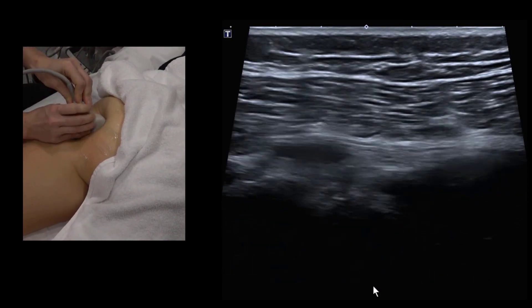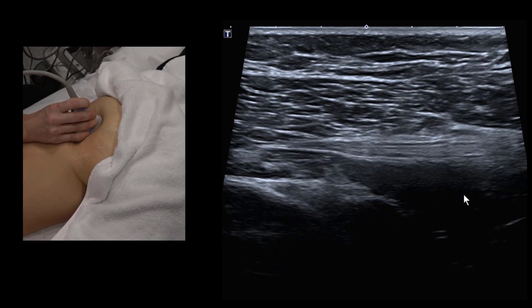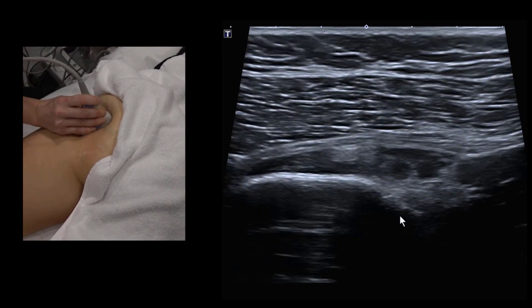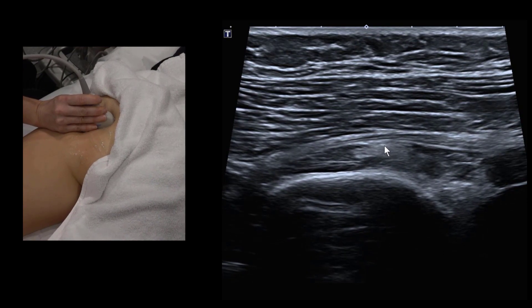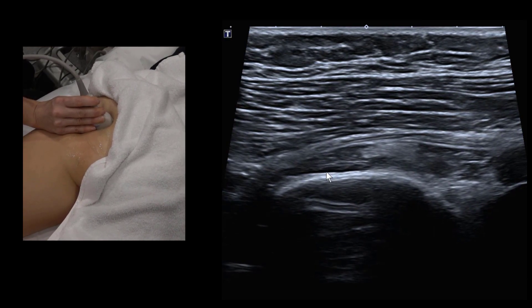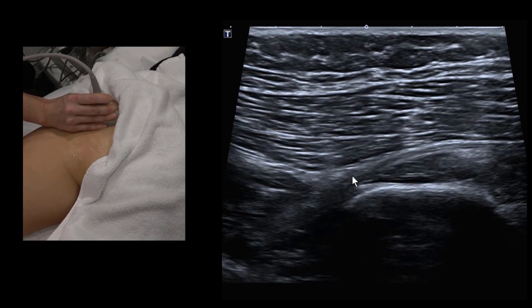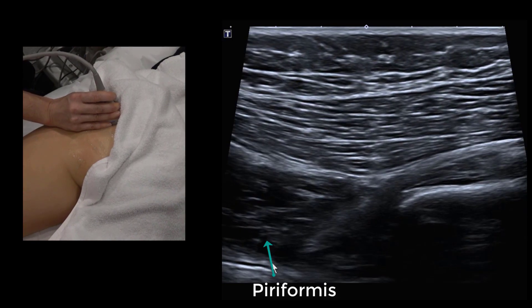In longitudinal on the nerve, sitting lateral to the ischium and just above the quadratus femoris, follow the nerve superiorly — you need to rotate the top of the camera towards the sacrum, more like 1 o'clock to 7 o'clock on the left buttock. We can see a black-white-black pattern: the hypoechoic muscles are inferior gemelli, obturator internus, and superior gemelli.